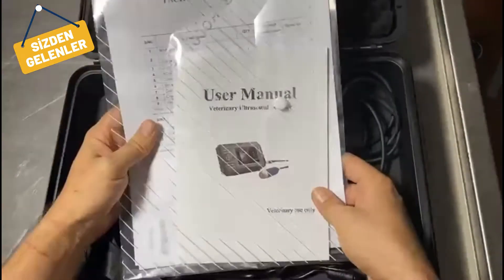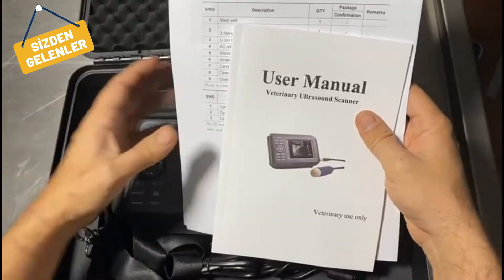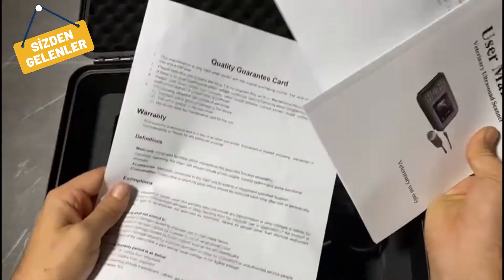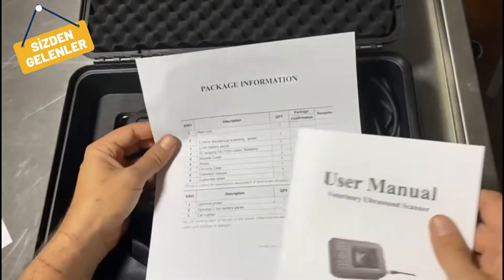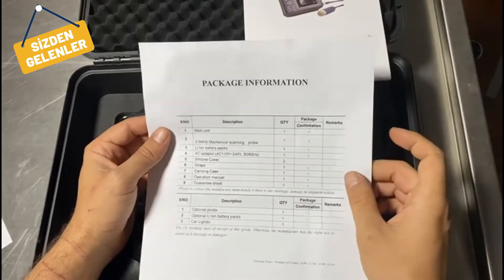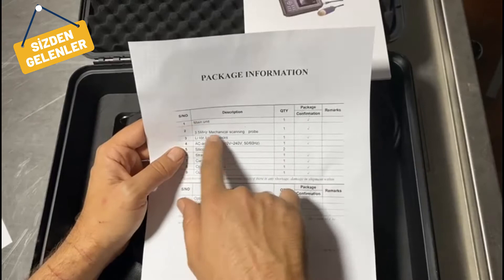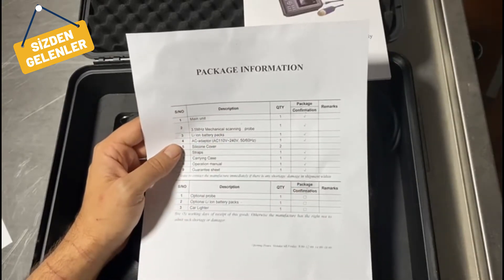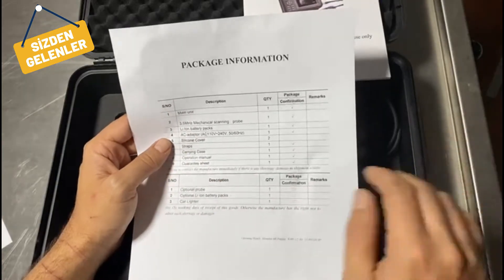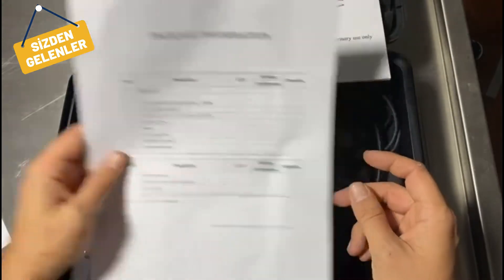First we have a dossier containing the package information and the user manual. So what do we have inside — also a guarantee card. In the package we have the main unit, a sectoral probe, battery adapter, silicon cover, straps, carrying case, operation manual, and guarantee sheet.